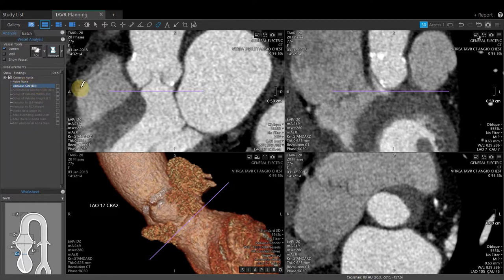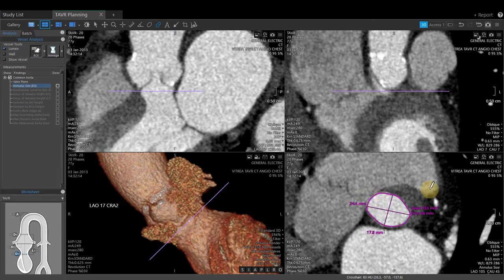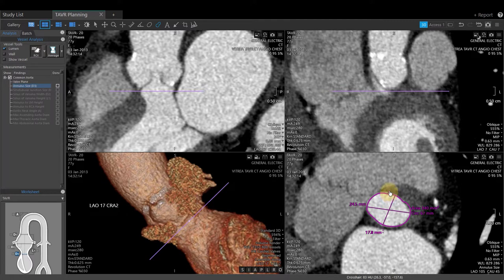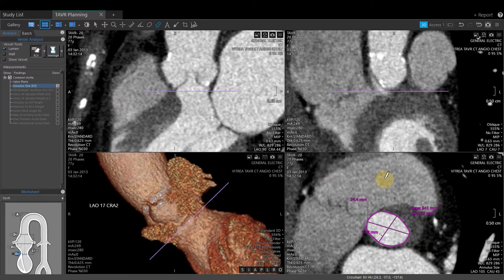With the annulus size measurement active again, instead of double-clicking in the middle, do single clicks around the perimeter of the annulus to drop points. When dropping the last point, double left-click to close the contour and create the measurement. Edit as needed by left-clicking and dragging, or hover over a specific point — a hand with a finger will appear — and left-click and drag that point. Click Done in the measurement list to lock it in, then take a snapshot at the upper right-hand corner of the axial viewport.